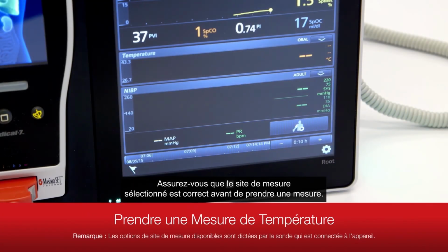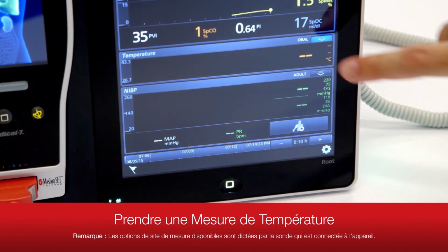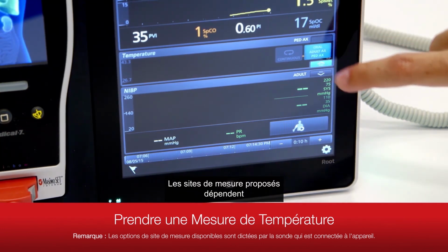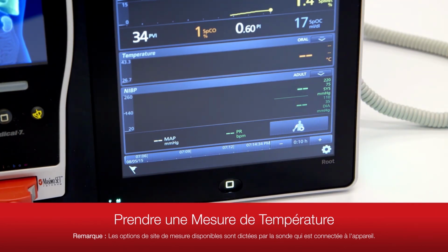Ensure that the correct measurement site is selected before measurement. To change measurement site, touch the Action menu in the temperature window. Select the correct measurement site. Note: the available measurement site options are dictated by whichever probe is connected to the device.